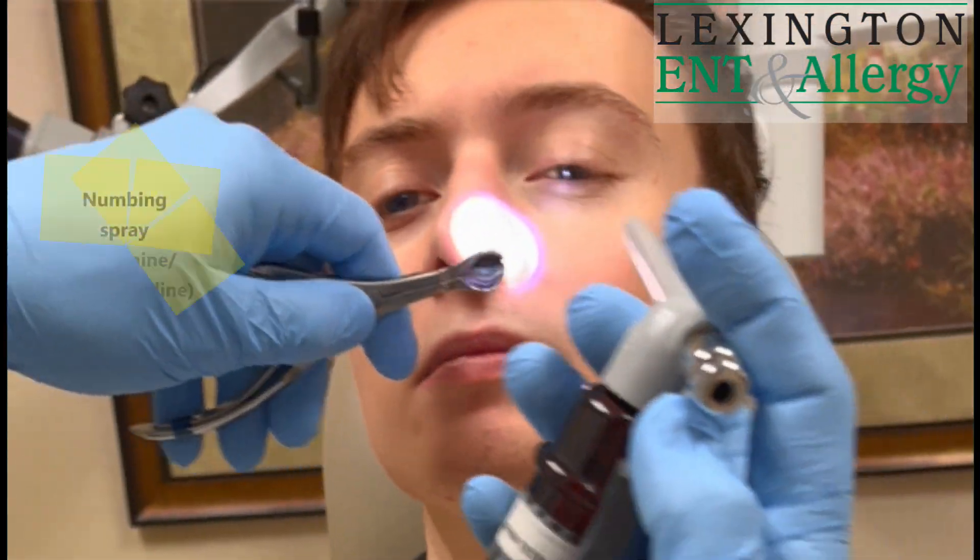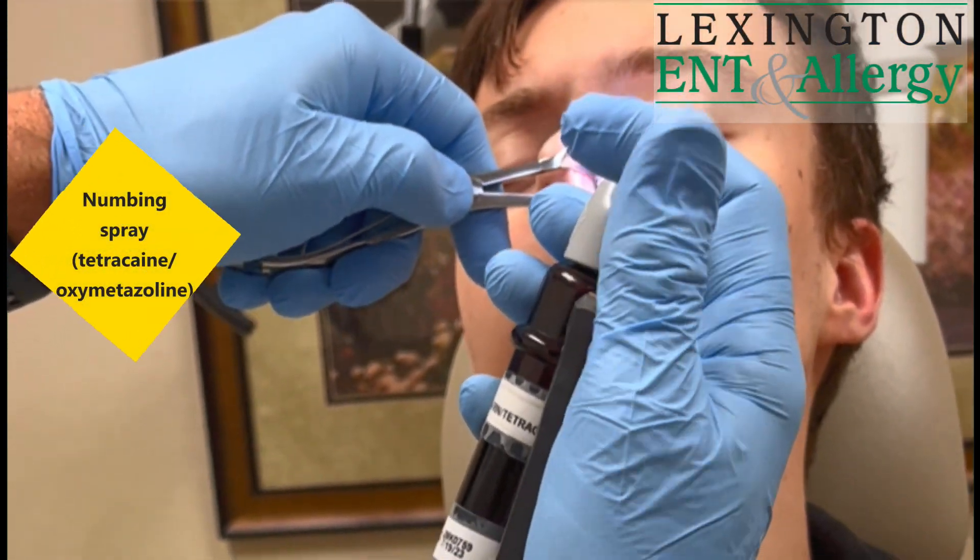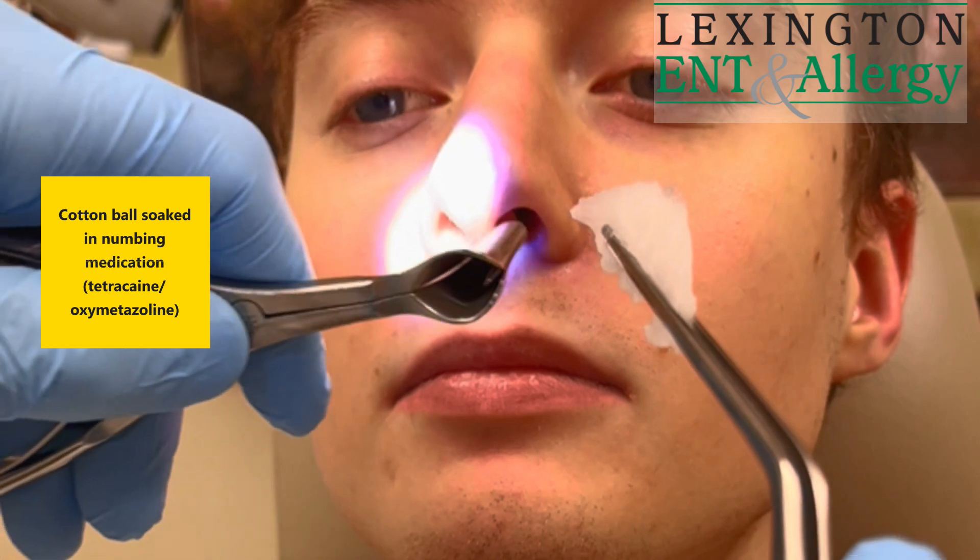This is a numbing spray called tetracaine mixed with some Afrin. Put a little of that in your nose. Just got a cotton ball with that same medication and I'm going to put that in.